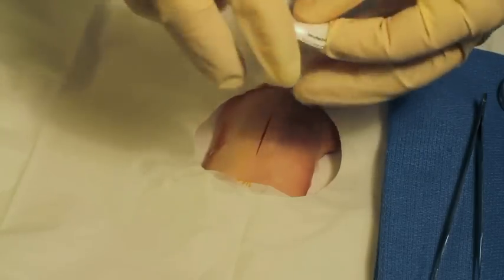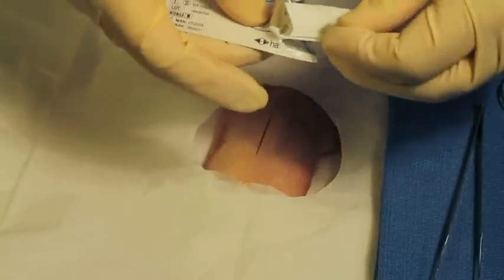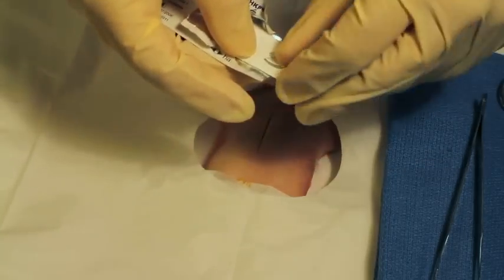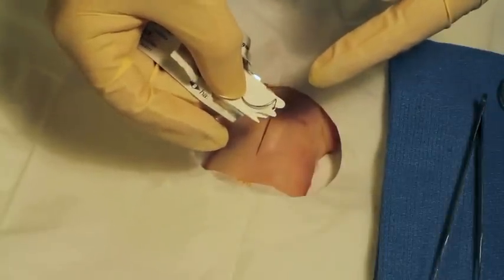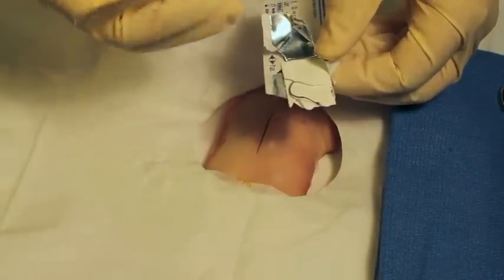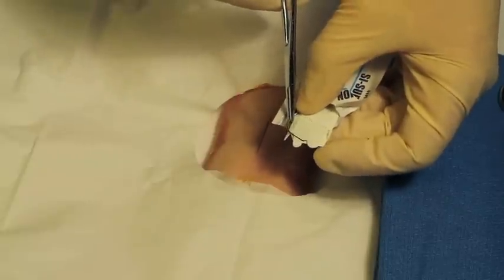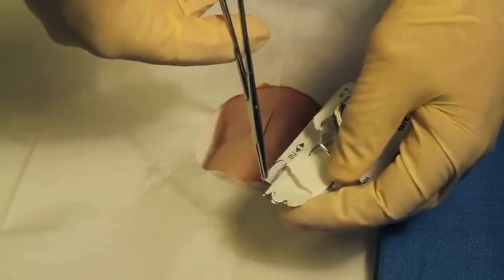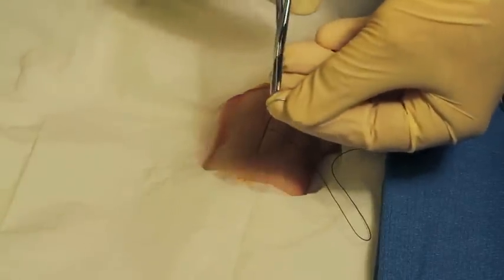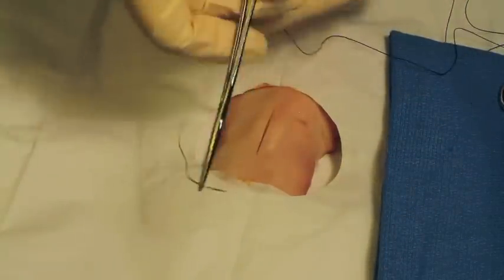Remove your little packet with the actual needle and string. These are made to be nice and secure — and there's your actual needle. Now using your needle holder — this instrument here, which comes in a standard suture kit — you're going to grasp it right in the middle of the semicircle there, the curved needle, and pull out the string keeping it all on the surgical field. That's pretty much how you're going to want it to be, just like you see it there on the needle holder.